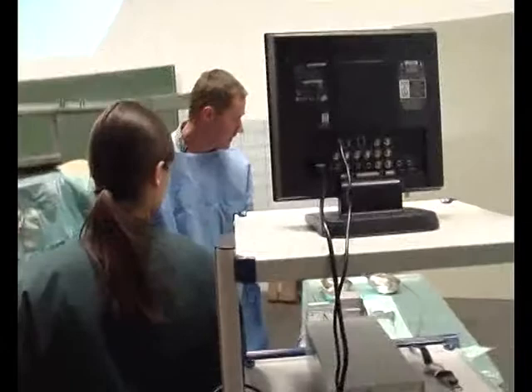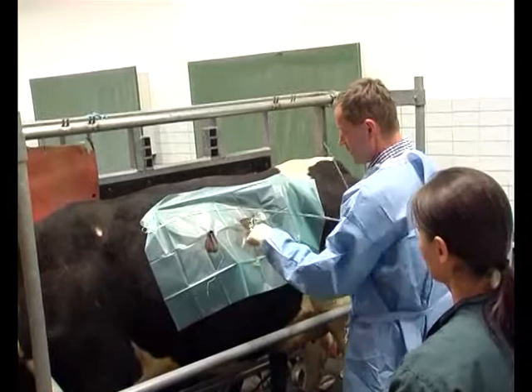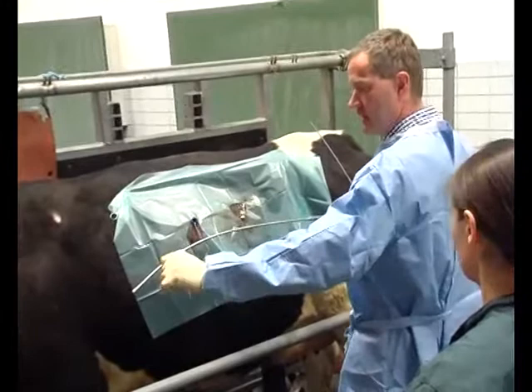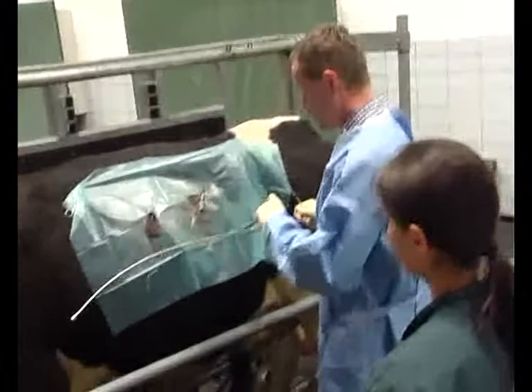Now we arrange the applicator. And this is one of the first versions of the applicator. And this is bended. And this is not quite solid. We prefer a more solid version because then you have more possibilities to reach the other side and without any bending in it. Only the tip should be bended. So I think Christiansen, he preferred this bended version, but we prefer the more solid straight version.